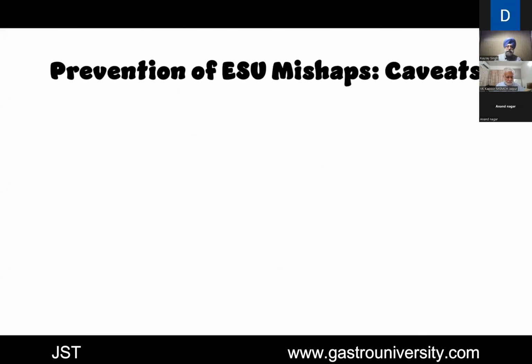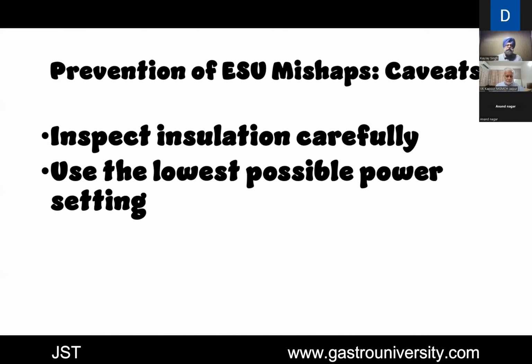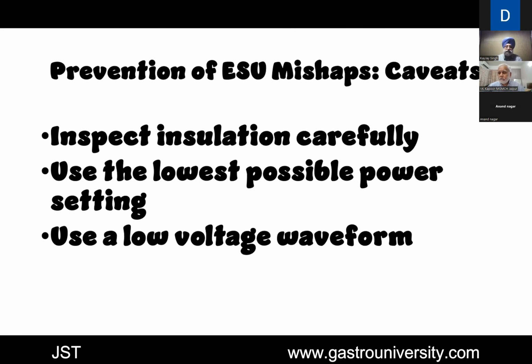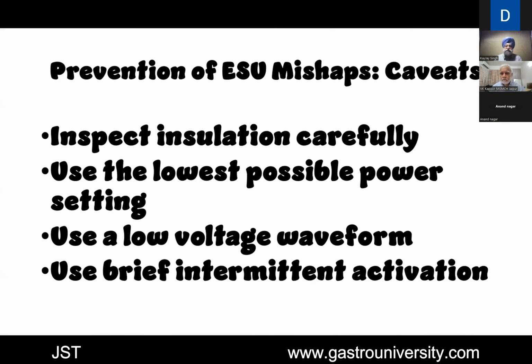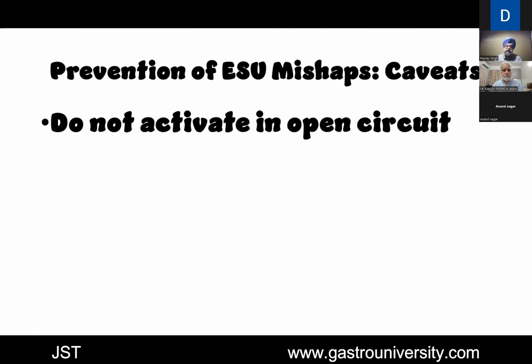I'll come to the concluding slide. Prevention of electrosurgical unit mishaps, caveats. Inspect insulation carefully. Use the lowest possible power setting. Use a low voltage waveform. Use brief intermittent activation instead of just standing on the foot pedal. Hemorrhage control or hemostasis is a skill, and cautery is not the answer for that. Cautery means ESU.